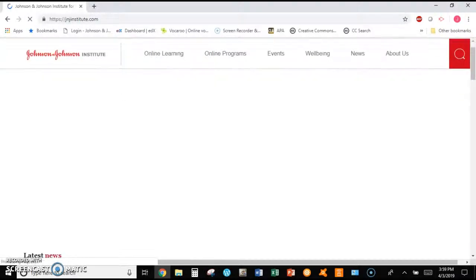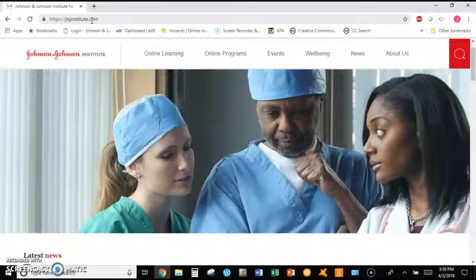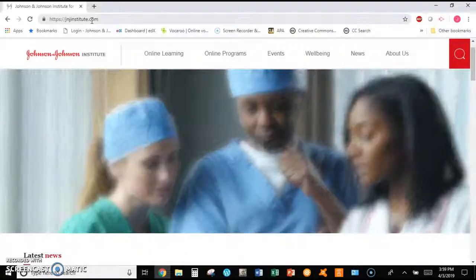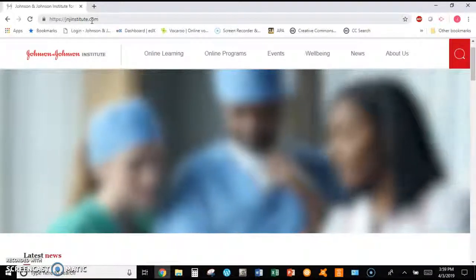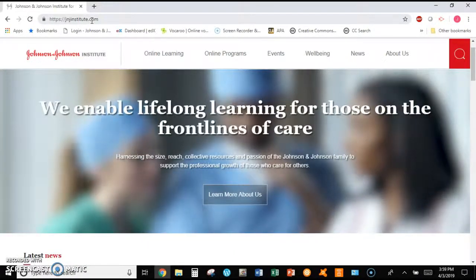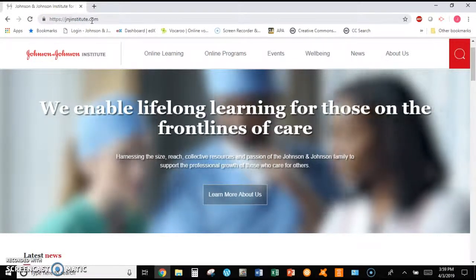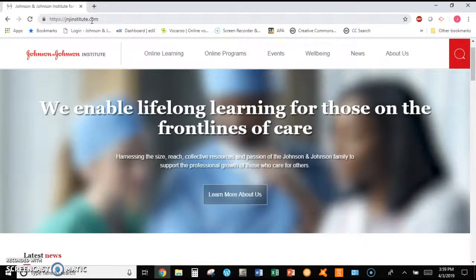This is the J&J Institute website from Johnson & Johnson. The goal here is to support the professional growth of those who care for others. This website, along with 24 centers around the world, provides ongoing learning opportunities that result in improved patient outcomes. Let's see what's available for cath lab and EP lab staff interested in learning more about cardiac ultrasound.